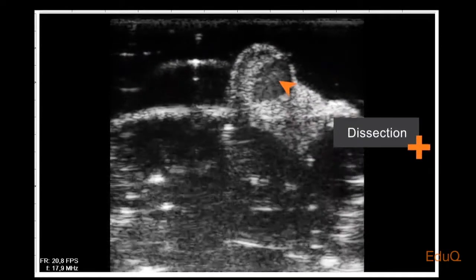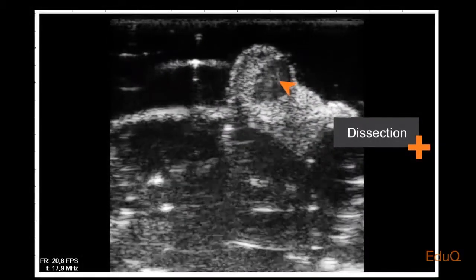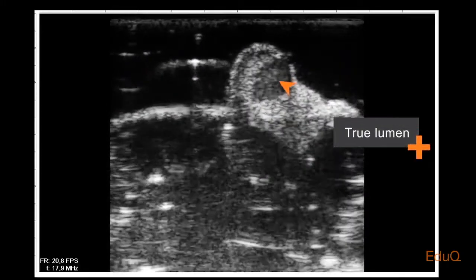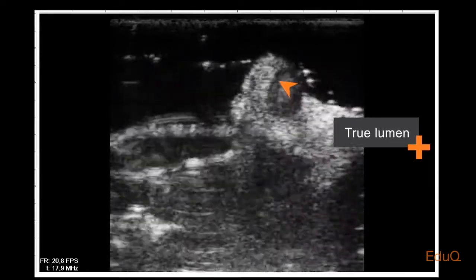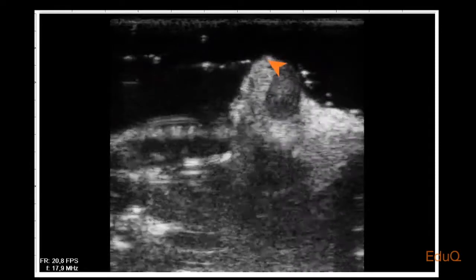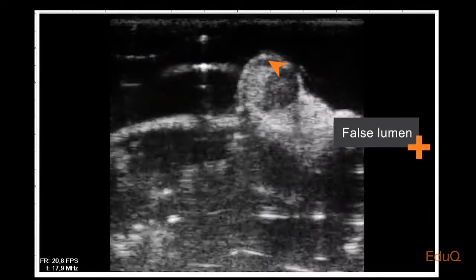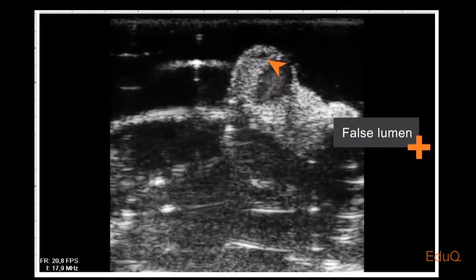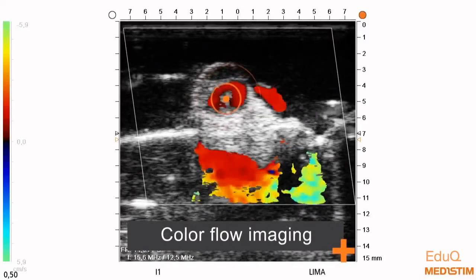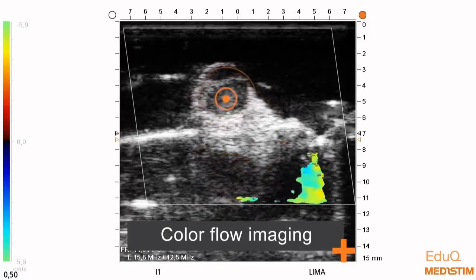And this is where the dissection goes. This arrow points to the true lumen. And a bit further to the left, the false lumen. This is also quite easy to see on the color flow imaging, where you can see flashes of blood flow in the true lumen.